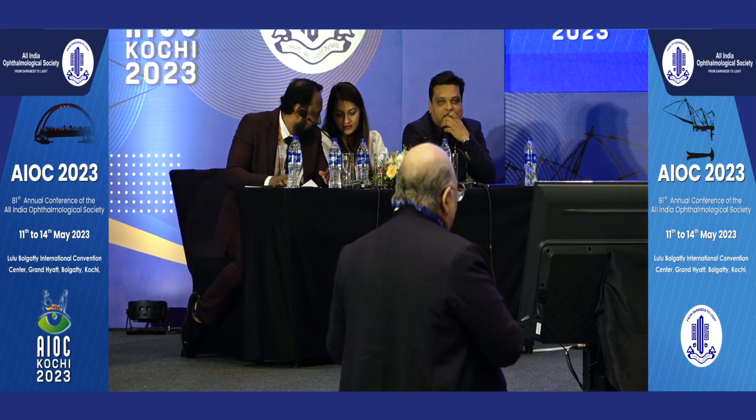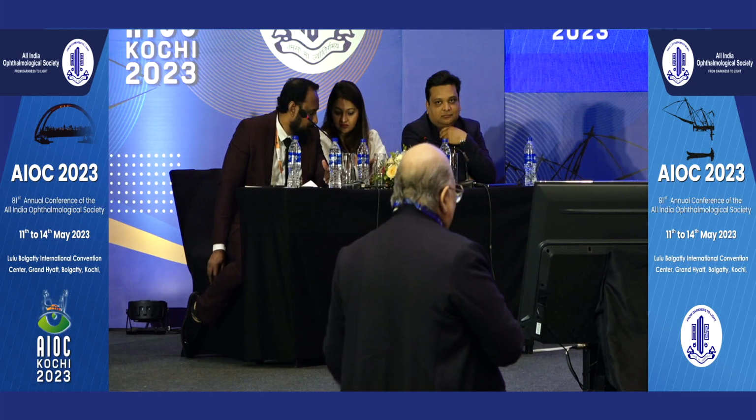So that remains the point of view that I still feel that giving 3 ranges of vision is far better than giving 1, irrespective. The only ones who are happy with a single range of vision are business people who sit at a table, or those who want to play golf, for example. They are happy with it. But all working people like you and me require trifocals.